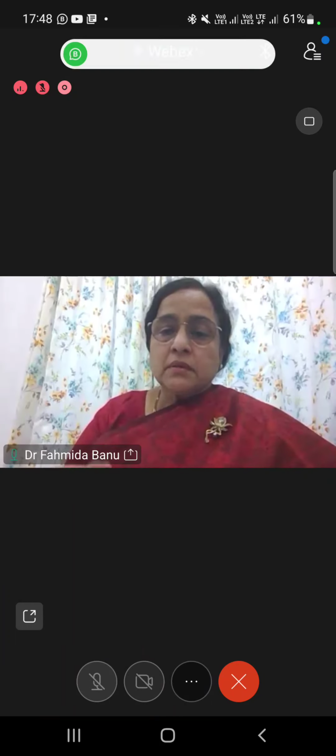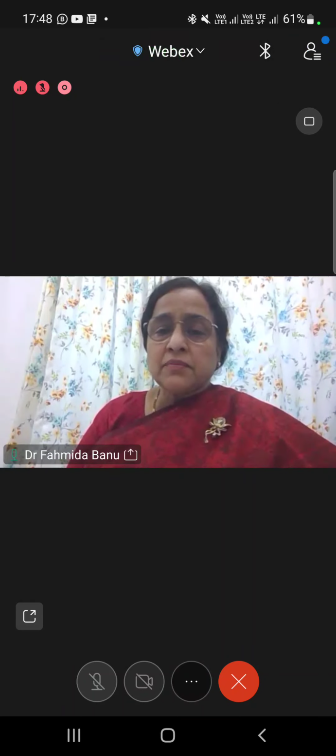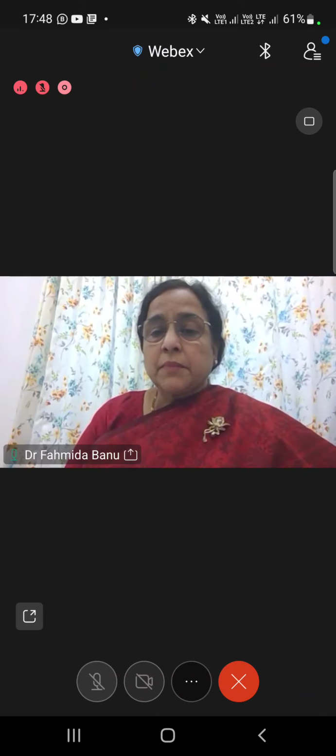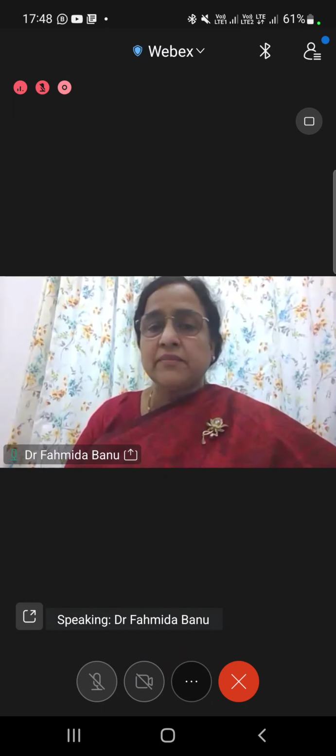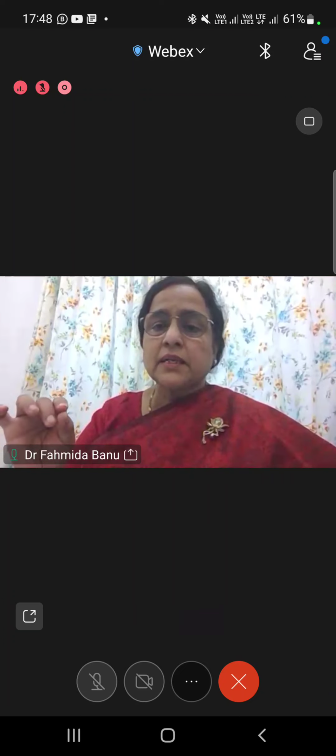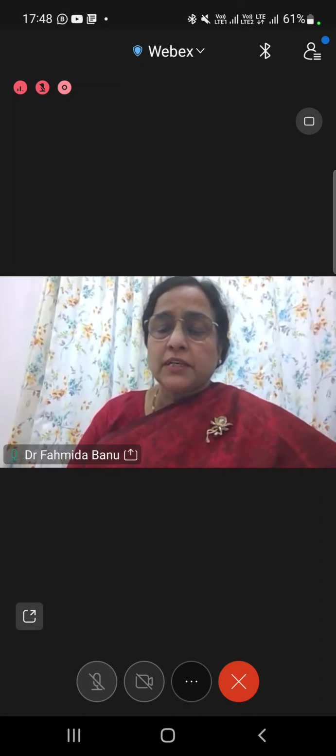For example, if you are overdoing the procedure, there is a possibility of the underlying myometrium getting necrosed and thereby an increased chance of infection. But nowadays, all these higher end devices have inbuilt time factors. They will get automatically switched off. For example, Thermachoice, after 8 minutes, it will get automatically switched off. Cavaterm, after 15 minutes, it gets switched off. There is nothing like overtreatment.